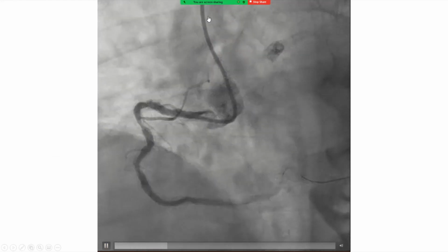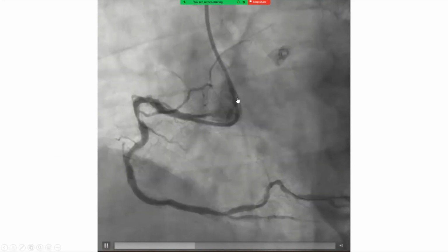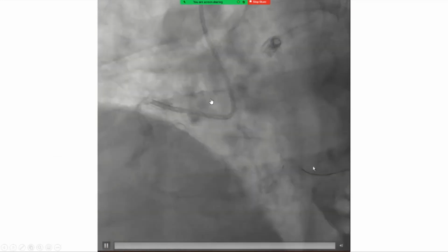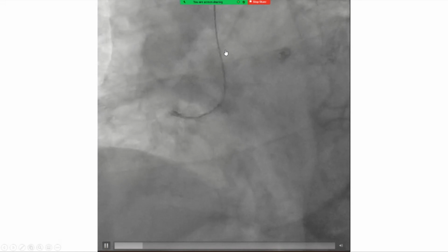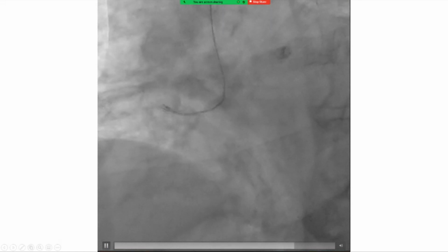This is another illustration of that deep power position. So the catheter is deep and it's sitting on the opposite aorta and on the right cusp aortic valve. And you can pull it back to create a JR4 shape. And here we're showing how we're pushing it to get that power position.